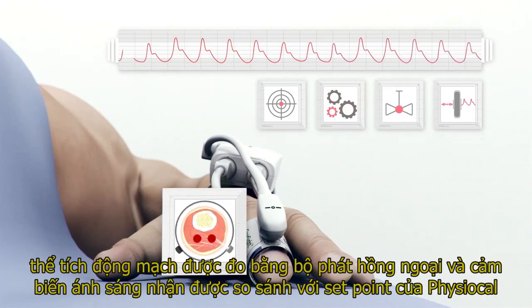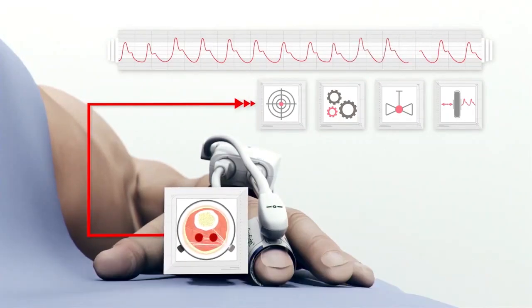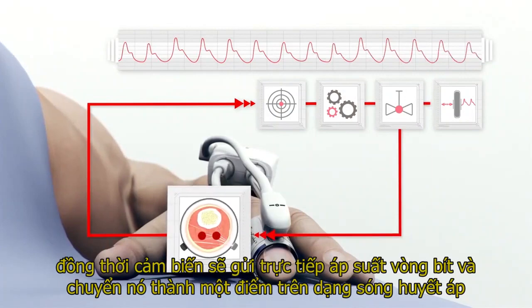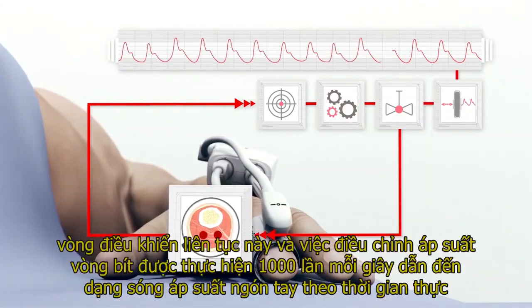The arterial volume, which was measured by the infrared transmitter and receiving light sensor, is compared to the PhysioCal set point. The pressure needed to counteract any arterial diameter change is determined by a controller. The controller then sends a signal to the control valve, which dynamically manages the amount of pressure applied to the finger cuff. At the same time, the transducer directly senses the cuff pressure and translates it into a point on the blood pressure waveform. This continuous control loop and adjustment of the cuff pressure is performed 1,000 times every second, resulting in a real-time finger pressure waveform.